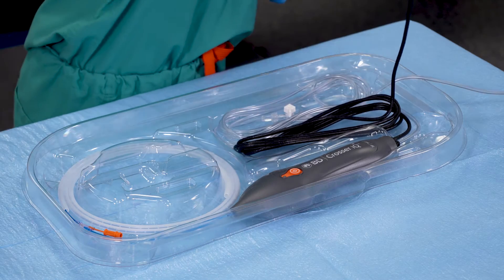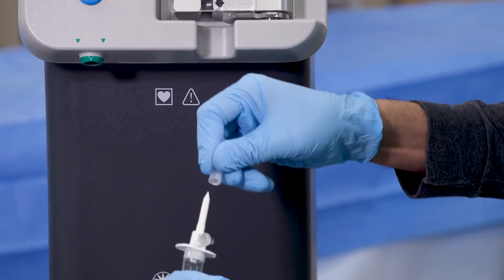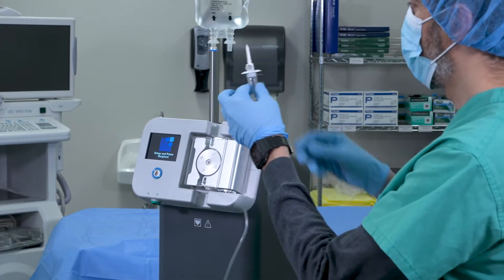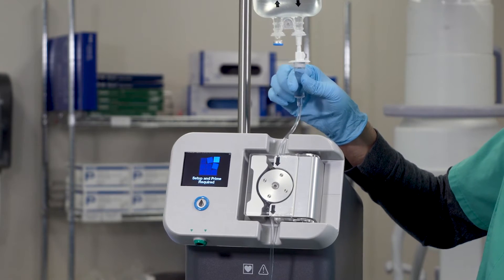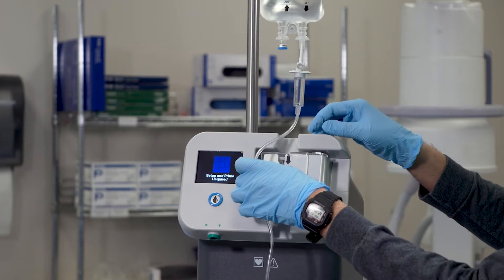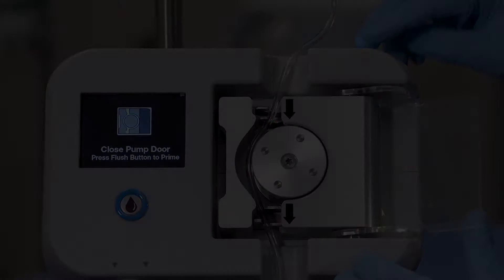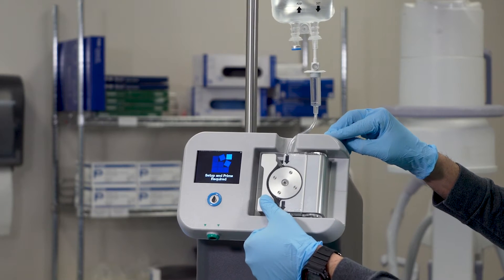Hand the device power cable and saline spike set over to the non-sterile field. Remove the cap from the Crosser IQ Ultrasonic CTO device saline spike set, spike the saline bag, and prime the spike chamber by squeezing the saline bag. Next, open the pump door and start to feed the saline tubing through the roller pump on the right side of the top and bottom tubing clamps, ensuring there is proper orientation for the saline to flow through, then shut the pump door.